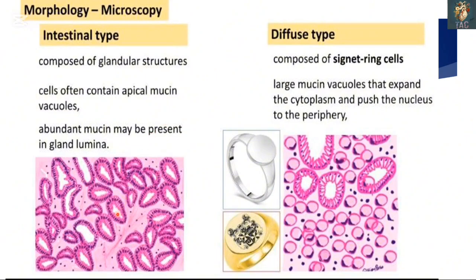Here you can see malignant glandular structures all over the image. The nuclei are hyperchromatic, which is the hallmark of anaplasia, and anaplasia is the hallmark of carcinoma. Desmoplastic stromal reaction, again, this fibrous tissue is invading and surrounding all the malignant glandular structures.